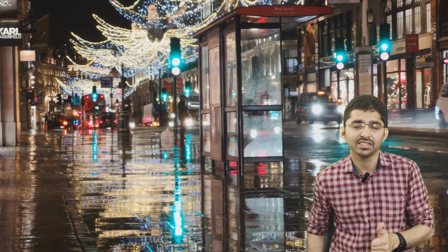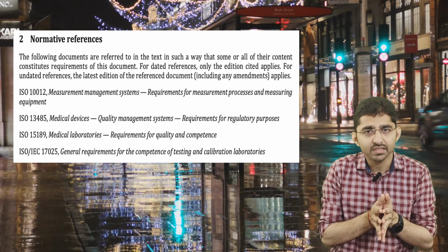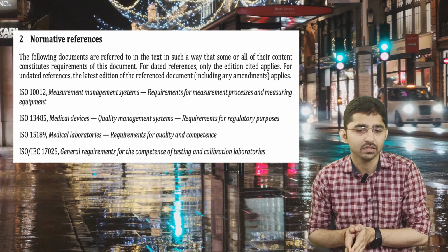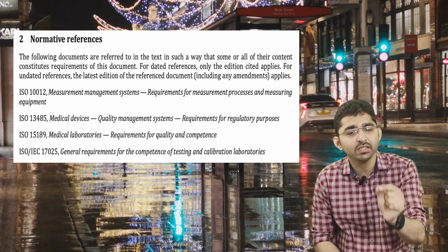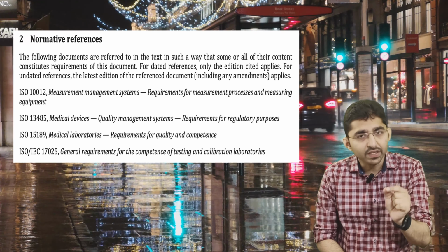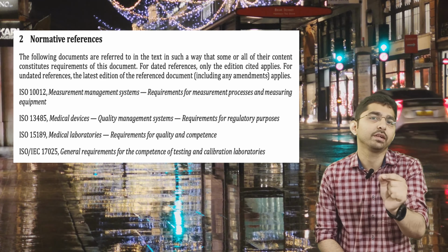Clause number 2 is the normative references. So this standard is in subsequent reference to certain other standards. The first one is ISO 10012, which is Measurement Management System. ISO 13485, which is medical device quality management systems requirements for regulatory purposes.